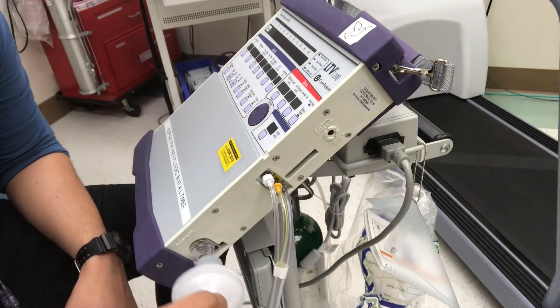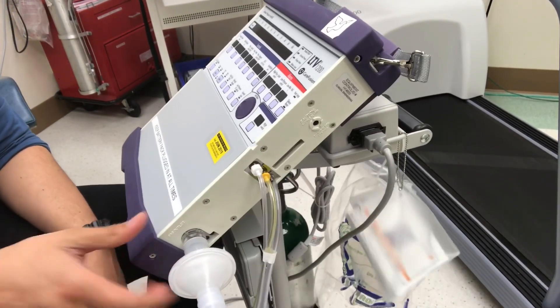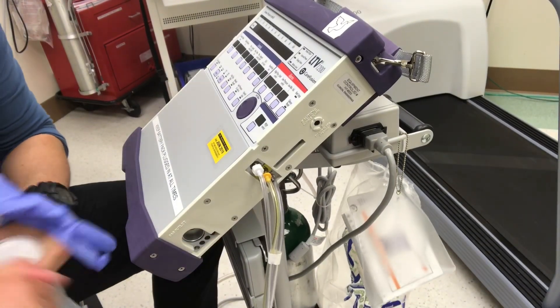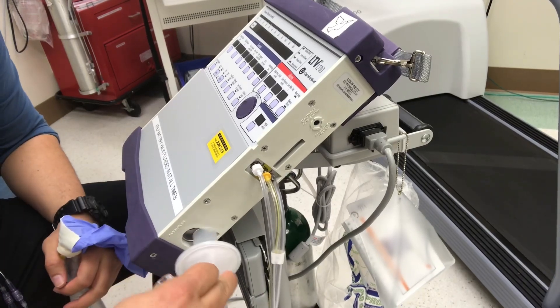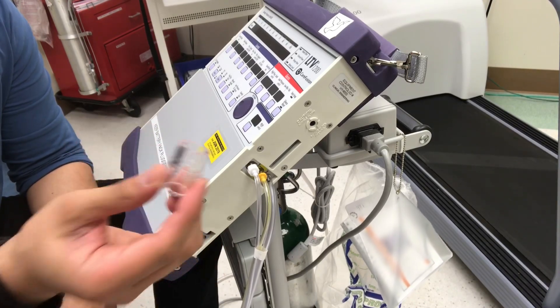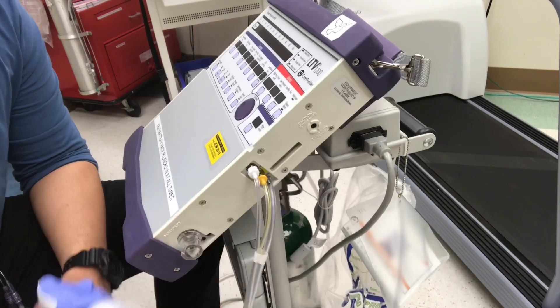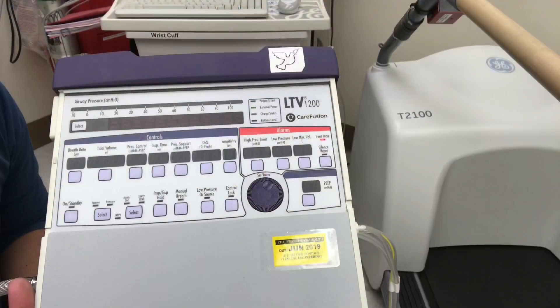It's very important to know that this 15-millimeter connector on the LTV can come off. If it comes off, the vent is inoperable because it won't connect without it. So make sure that the 15-millimeter connector is secure — we keep extras available. Make sure it's seated properly so the vent runs correctly.